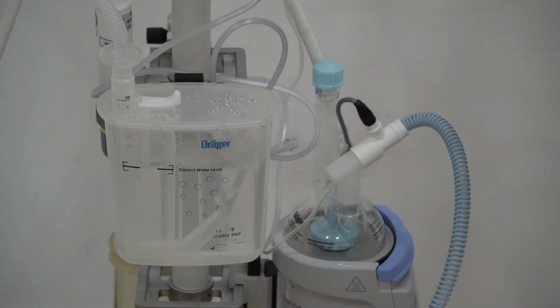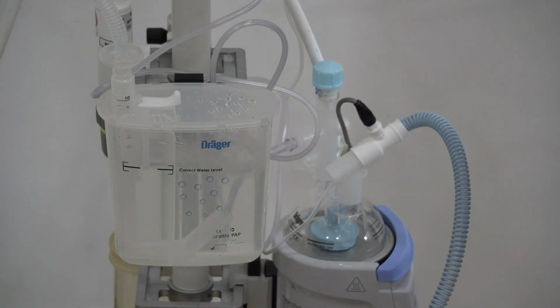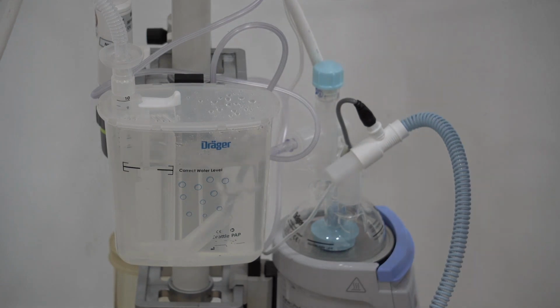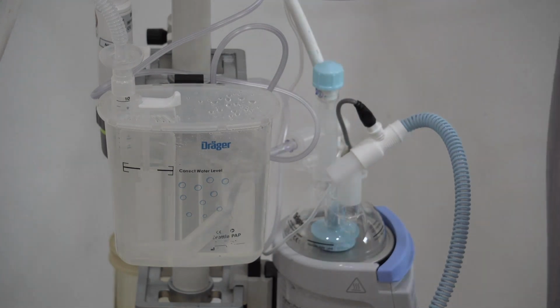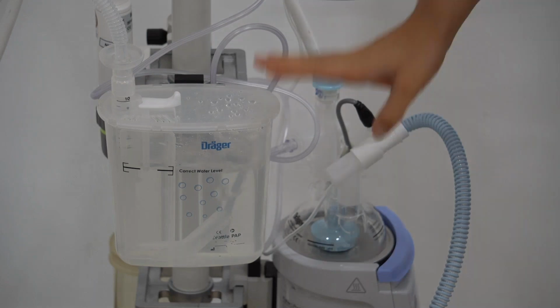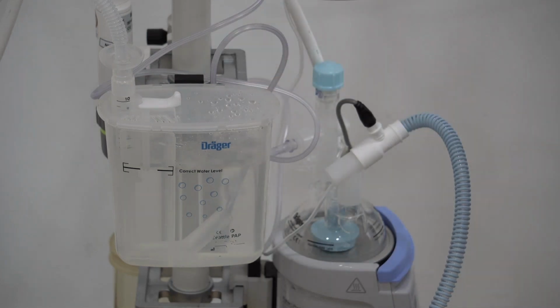Also, I think it's important to say something about the concept of the Bubble CPAP. As Linda has mentioned in her slides, CPAP equipment is basically generating a stable level of continuous pressure that, by maintaining the same pressure, prevents the alveoli from collapse. And the Bubble CPAP in particular generates this pressure by bubbling of the water, and thus creating a certain level of oscillation.